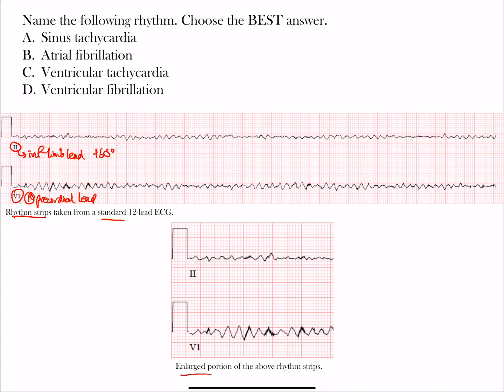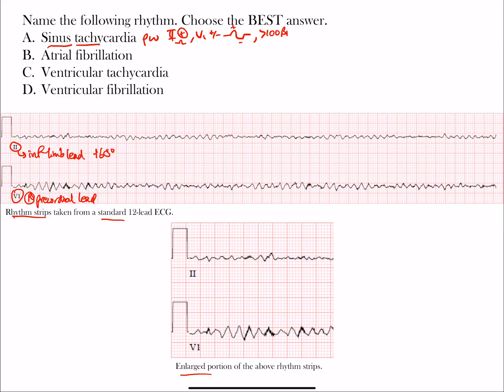Choice A is sinus tachycardia — a sinus rhythm that is fast. P waves should be present. In lead II we should see positive P waves, and in lead V1 we should see either positive or biphasic P waves, representing right atrial depolarization followed by left atrial depolarization. The P waves are sinus P waves and we'd want a rate over 100 beats per minute — always assuming adult patients. P waves are upright in lead II because the normal P wave axis is between 0 and 75 degrees positive, and lead II sits within that range.